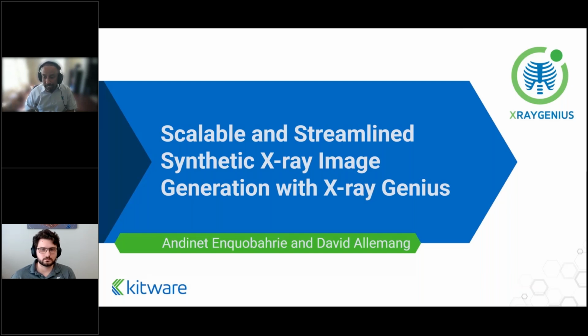Today, I'm joined by David Allemang. He's a Senior R&D Engineer at Kitware. David brings extensive experience in medical imaging and software development. And he'll be leading the demonstration of X-Ray Genius software, showcasing some of its capabilities and real-world applications.